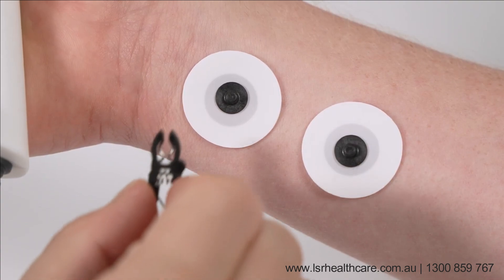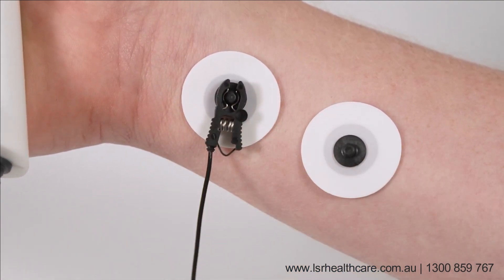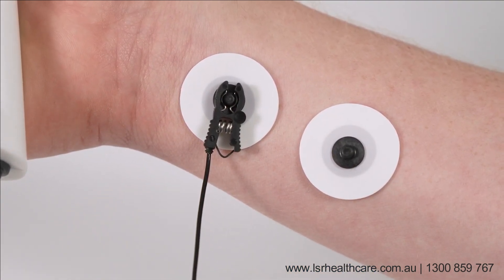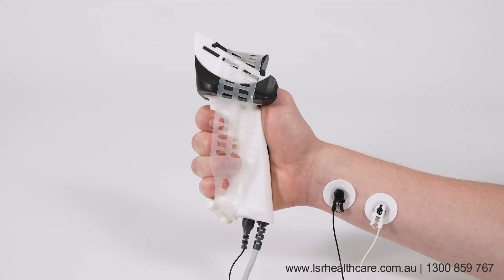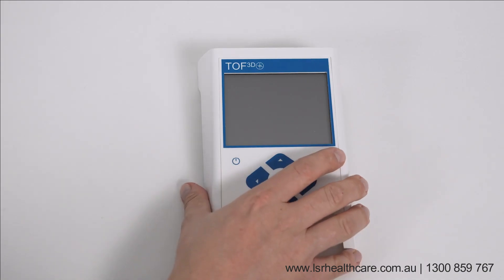The monitor will detect whether the AMG or MMG sensor is used. You will see AMG or MMG in the main display. The hand setup is complete and you are now ready for monitoring.